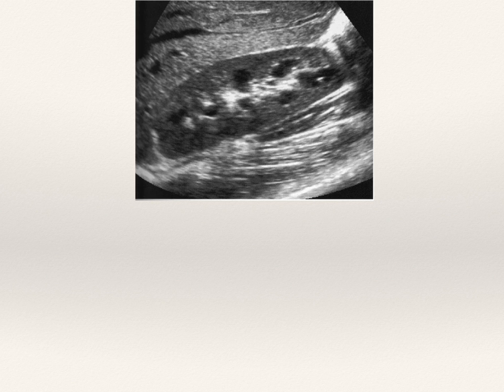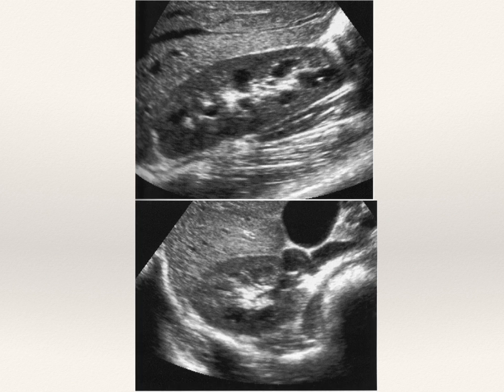And then if we were to rotate 90 degrees for the right kidney, this is what we'd see. Now with this view here, let's say that we are lateral on the patient for our probe, and then we've rotated the probe, if we're looking at the right kidney, 90 degrees. Which direction should our transducer marker be pointing? Up towards their head or down toward their feet? Or sorry, up toward the air or down toward the bed?